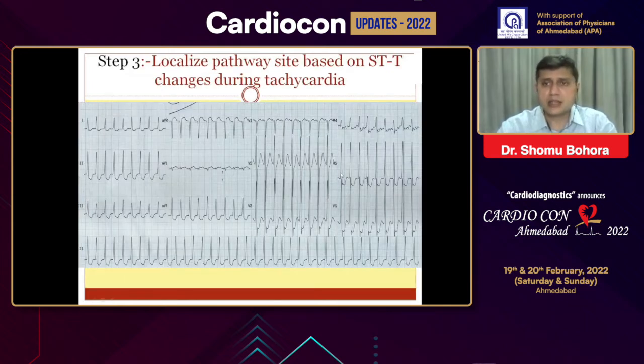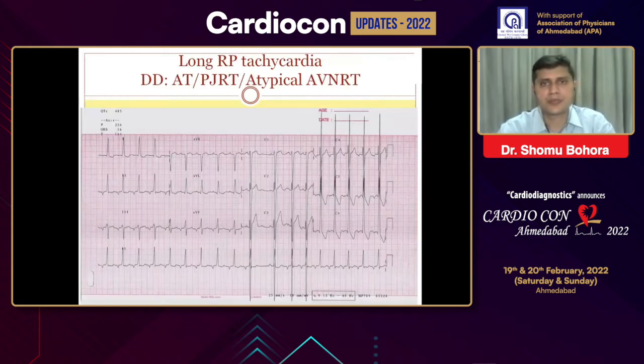Based on the STT changes, if you have significant STT changes in the inferolateral leads, that means the P wave is somewhere there, and therefore the pathway is likely to be in the inferolateral area, maybe the left lateral or left posterolateral.